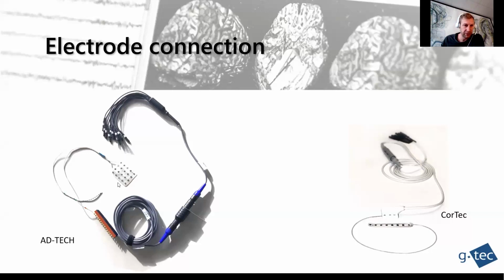for epilepsy treatment. And the second use case is intraoperative monitoring, for example, during awake glioma surgeries when the tumor has to be removed in an awake surgery use case. And then we have here usually the pigtail, so the connection is completely passive. There is no preamplification in the electrodes. Then we have the connection cable with the connector block, where the pigtail is inserted, and then the normal outputs are the 1.5 millimeter safety touch-proof connectors. And with this, we can connect them directly to a passive head box.